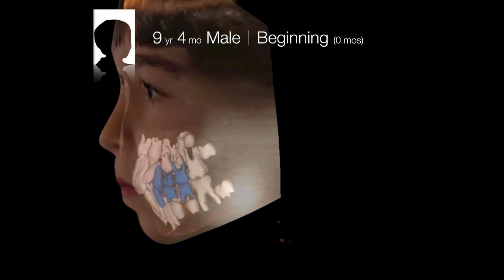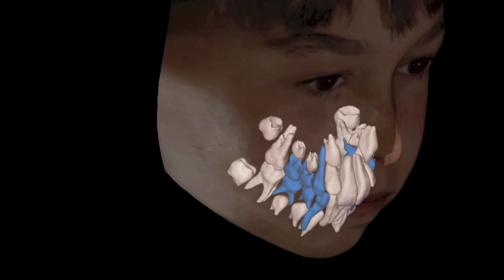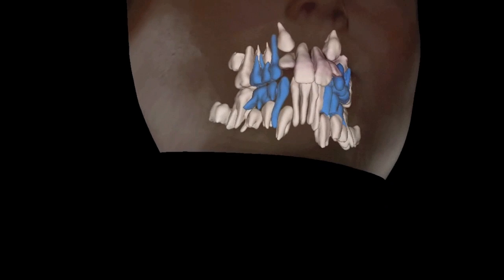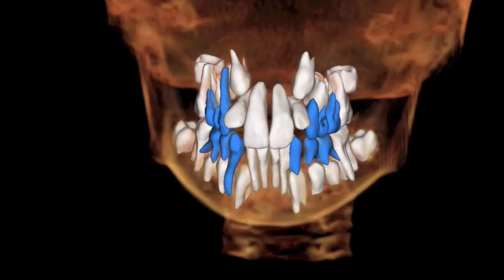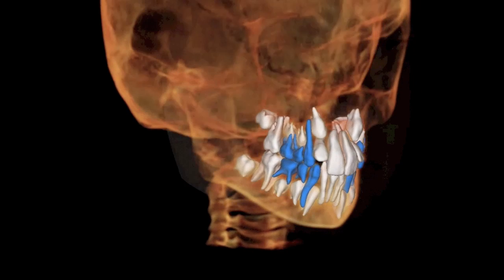However, when you look at the three-dimensional image of the same patient, and you examine the position of the maxillary canine teeth relative to the permanent maxillary lateral incisor teeth, it becomes quite apparent that this case is far more than just routine. These are the types of cases that I find I'm picking up in my practice over and over again, given the fact that I use three-dimensional imaging on all of my patients.